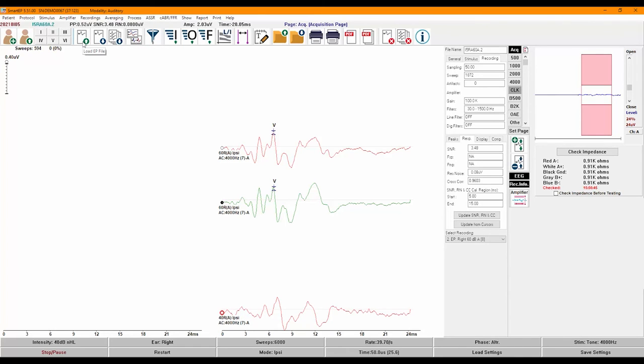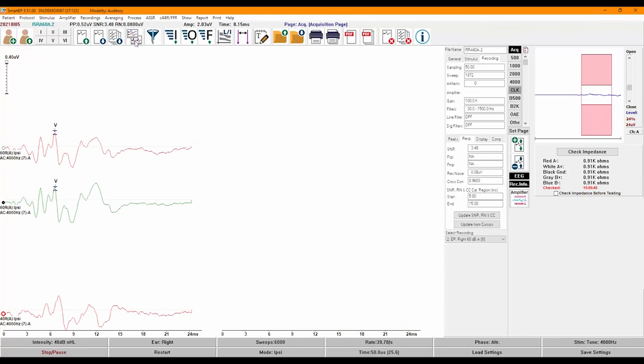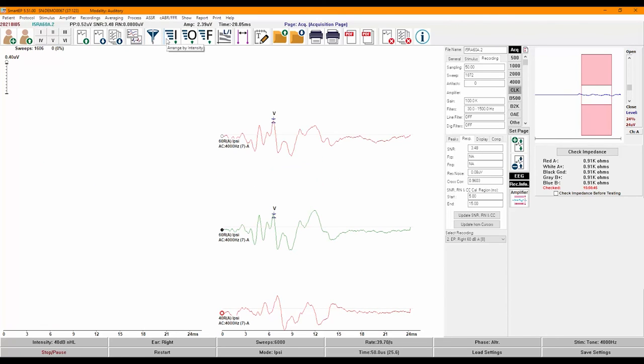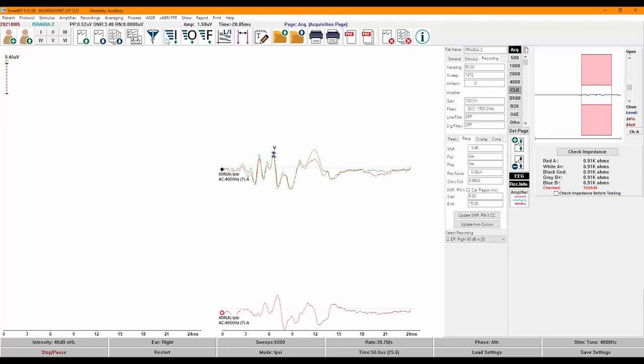The next icon allows you to load a recording, save a single recording, or save multiple recordings. All recordings are automatically saved upon completion, but these buttons allow you to manually save recordings that have been manipulated. Next, we have an option to toggle between a split page and a full page display. The next button allows you to apply a filter to the recording, such as a smoothing filter. The I, O, and F buttons allow you to quickly arrange recordings by intensity (I), order of acquisition (O), or frequency (F). Clicking on I will overlap recordings that have the same intensity. You can also arrange recordings by rate by typing the R key.